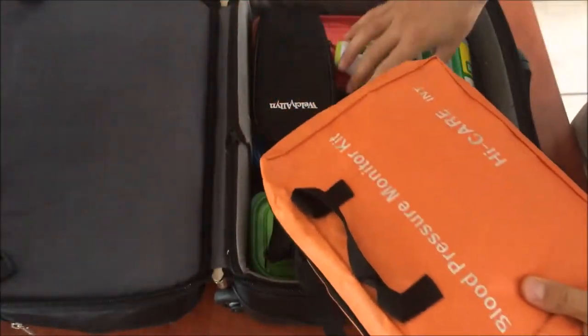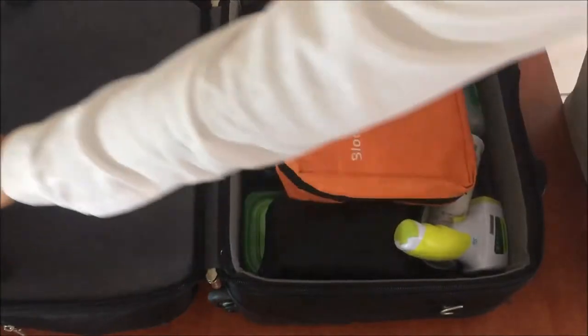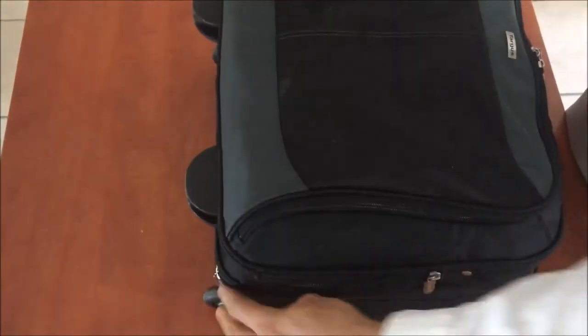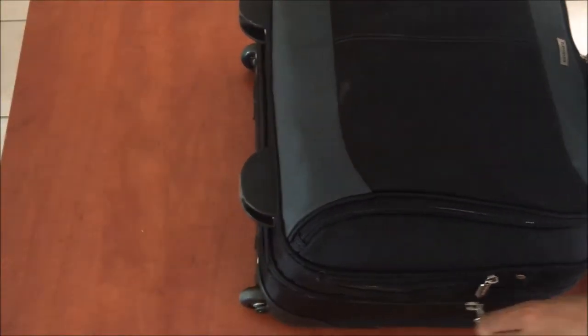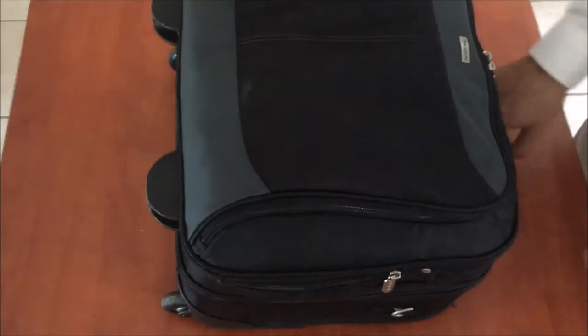So this is basically what I call my vitals kit. I can do all the vital signs — being the temperature, pulse, blood pressure, glucose level, and urine testing. And then we've got the big bag.